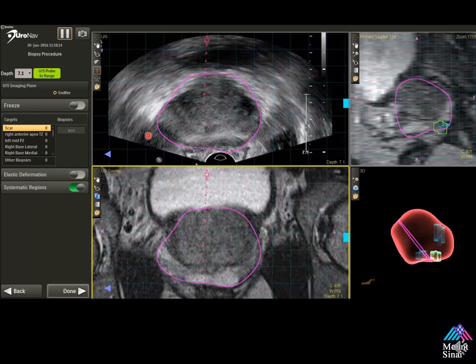Watch — this is a tricky spot. If you don't rotate and kind of undershoot, you may have the needle bounce off the prostate and miss it altogether. I thought this was an interesting case because it covered a lot of different aspects of the procedure.